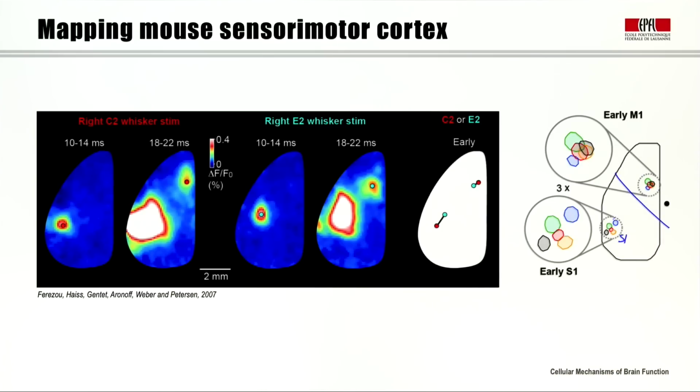And so we can begin to build up functional maps of both sensory and motor areas of the mouse neocortex by using voltage-sensitive dye imaging in vivo in awake behaving animals. Now, we would also like to be able to zoom in and look at higher resolution at this particular area here of the brain and study in more detail what's happening with cells, neurons, and synapses.